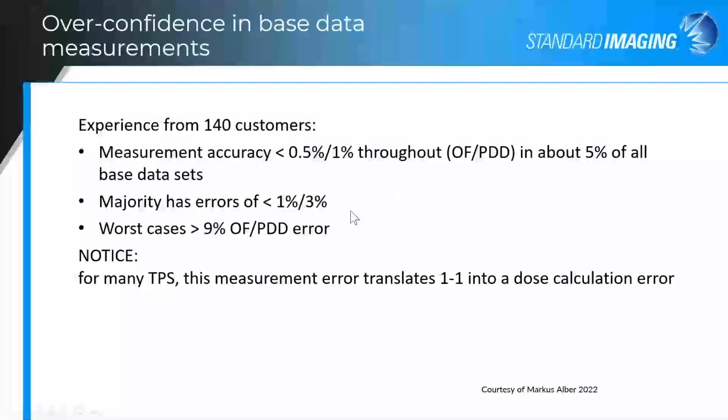And of course, everyone works really hard setting their water tanks up, trying to take the most accurate measurements possible.